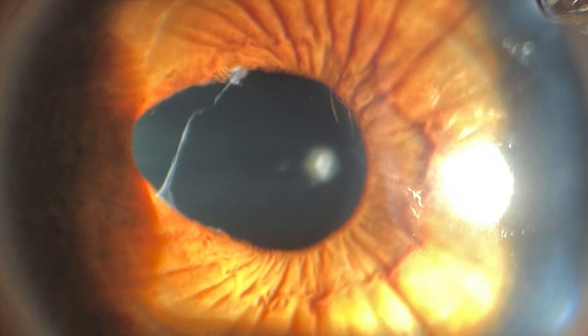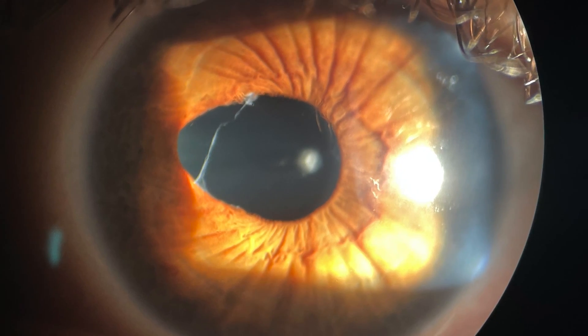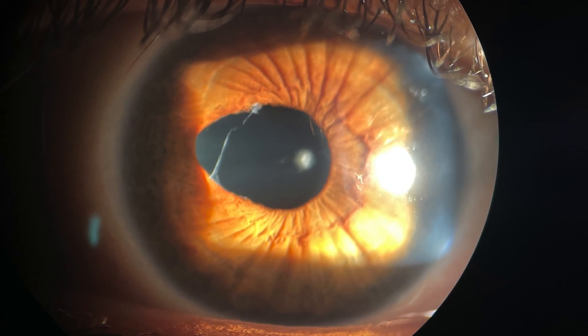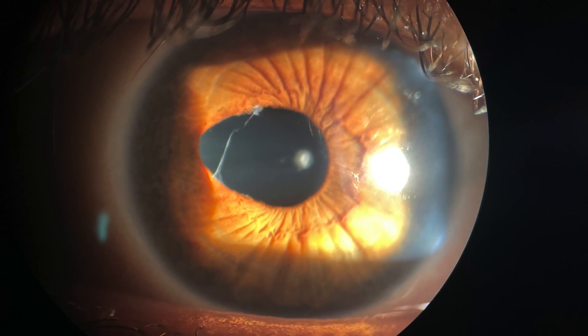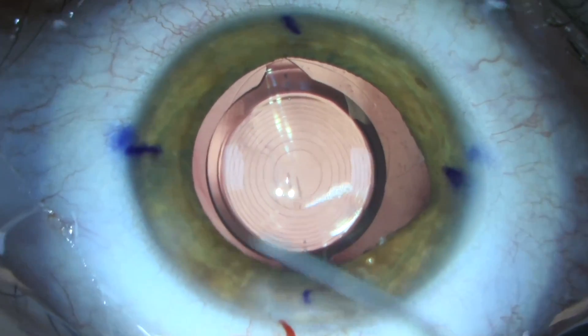She chose to undergo cataract surgery and pupilloplasty, which is a surgical repair of a damaged pupil. The goal was to normalize the size and shape of the pupil of her right eye and correct her traumatic cataract. This is our view through the surgical microscope in the operating room.